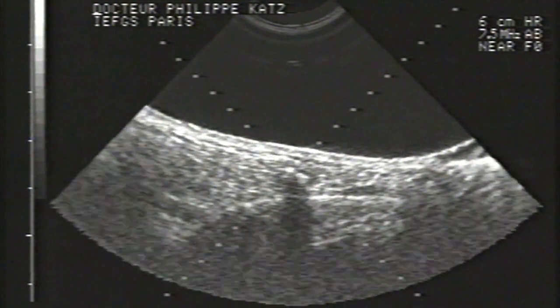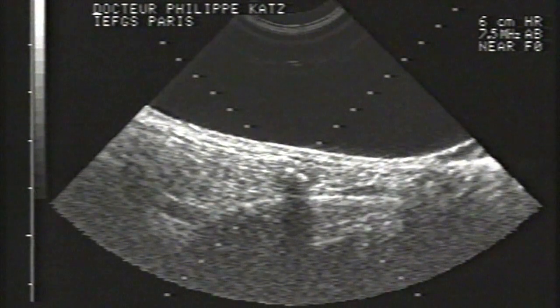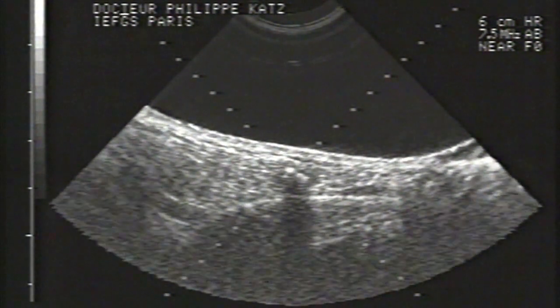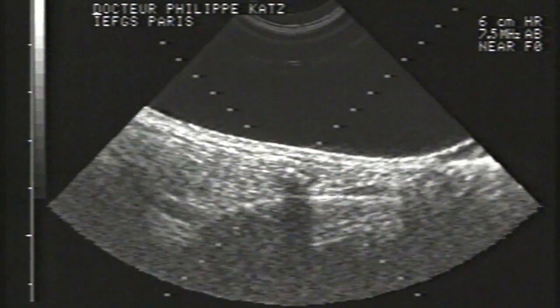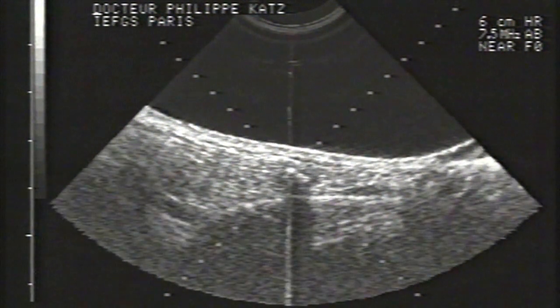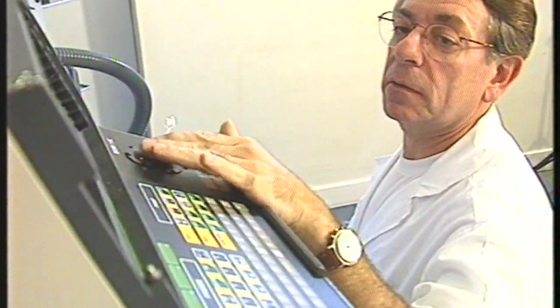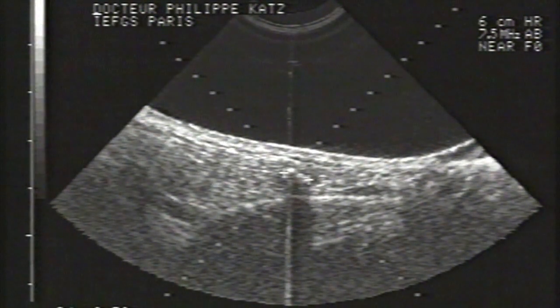The indication of this type of extracorporeal shockwave lithotripsy concerns stones located in the proximal part of the Wharton canal or in the gland itself, at the submaxillary level, no matter where the parotid is. This index permits stone size measurement.